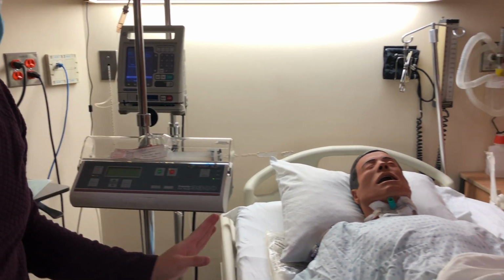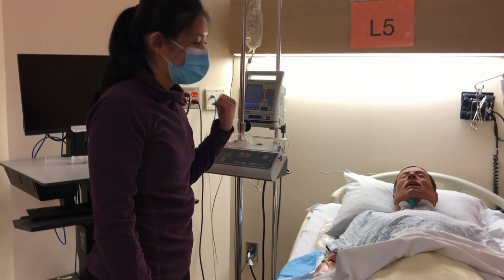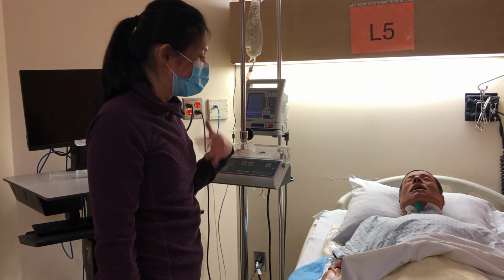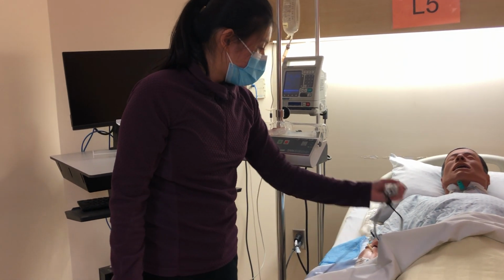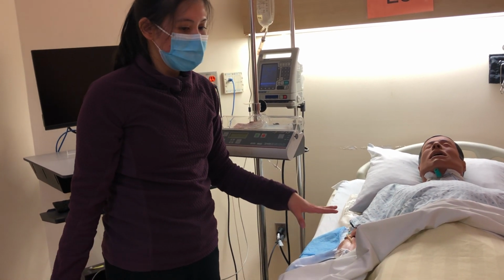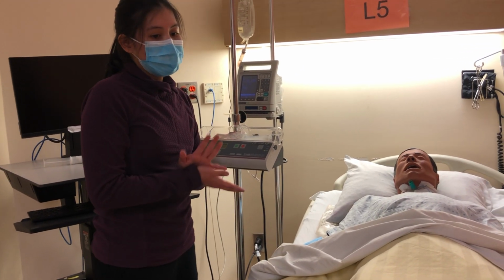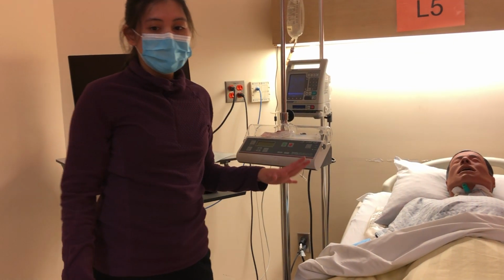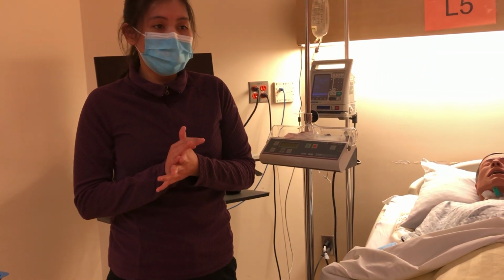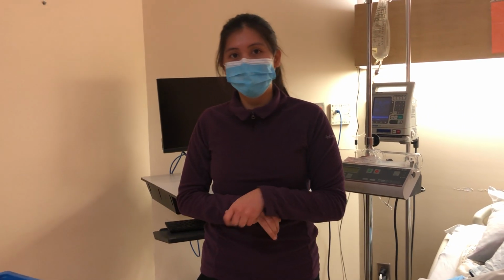Okay, so Mr. Tyson, your pain medication is infusing. Any of the side effects we talked about, please let me know. We will help you, but we will also be monitoring you closely. Your PCA button's here. Again, you're the only one who can use it. So if you don't have any questions, then we're ready to leave the room. So do an exit safety check: patient's not in distress, call bell within reach, bed is in the lowest position. And then I'm going to sign my MAR with my second nurse who did the checks with me. And that's it.